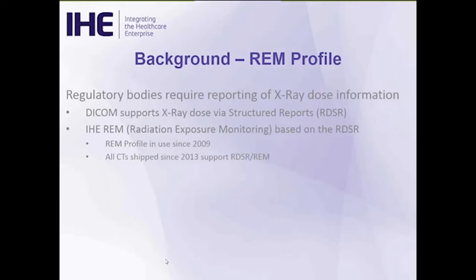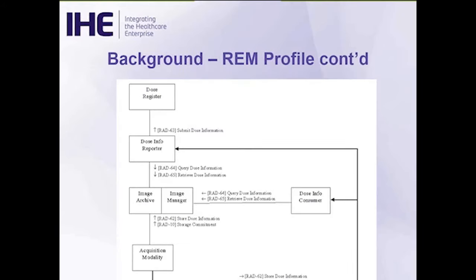As we said, there already is the REM profile, which deals with X-ray dose information. It's based on DICOM structured reports, and there's a specific template for X-ray dose. This was introduced around 2009, and as far as I know, all CT systems from about 2013 on have supported this profile. So there's a lot of infrastructure in place in institutions for dealing with dose report information.